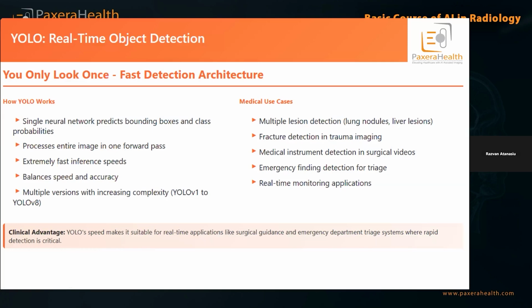And of course, it has multiple versions, but YOLO is something that's used quite a bit also, and it allows clinicians to quickly identify these lesions and abnormalities. Because it's fast, in this case, it's okay, because you can even apply it to real-time monitoring.